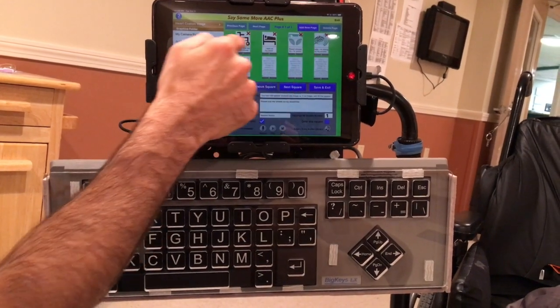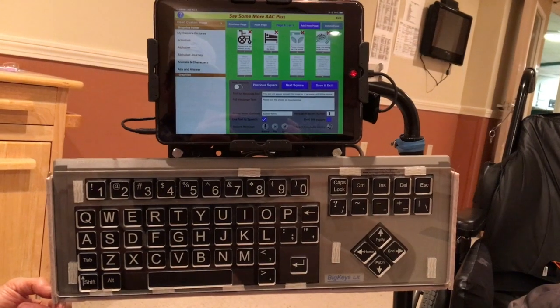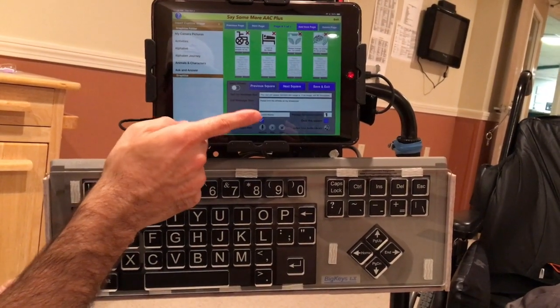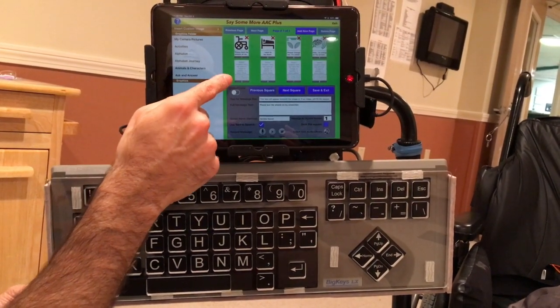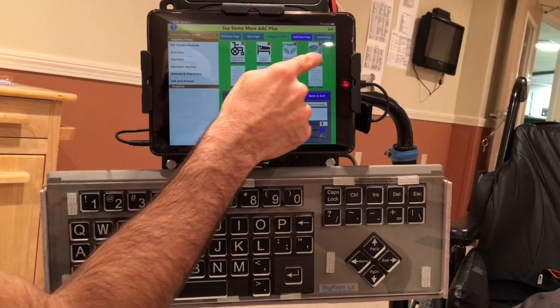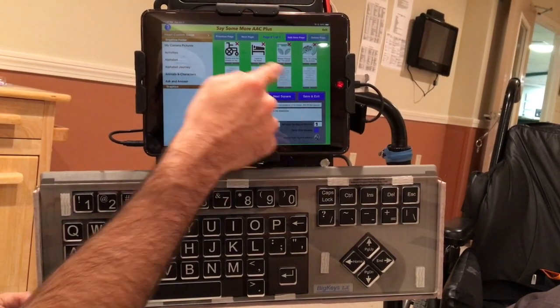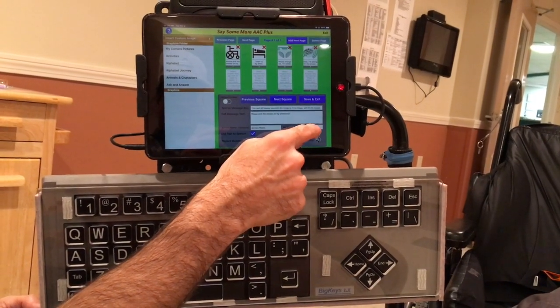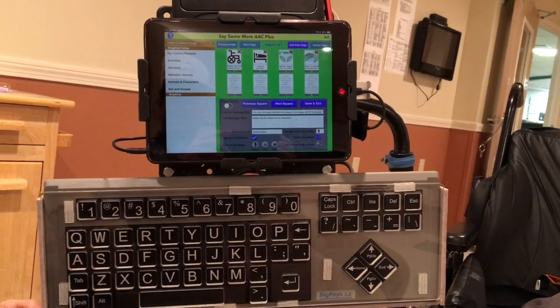And you can see here, I've got 4 parts of this conversation. These are novel phrases. This interface is a little bit confusing, so I'm giving you a video walkthrough. So basically, you can't actually select them just by touching on them. That's the first confusing thing. These are the 4 icons. You have to pay attention to this number here. So number 1, that means we're editing the first icon. It goes 1, 2, 3, 4, 5, 6, 7, 8.